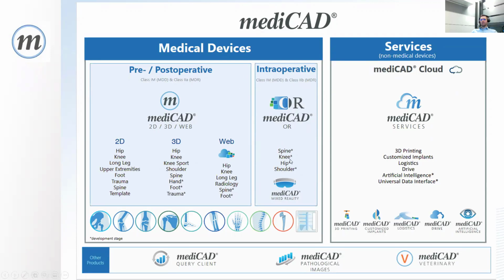I will show you a slide about that in a few minutes. For example, you can use the data on a C-arm or other digital devices. And we are also working on possibilities to use the data within a mixed reality lens. You will see a few pictures about that as well in a few seconds.